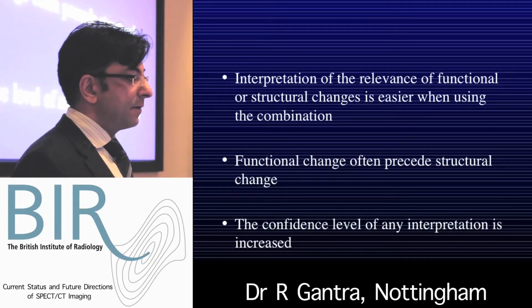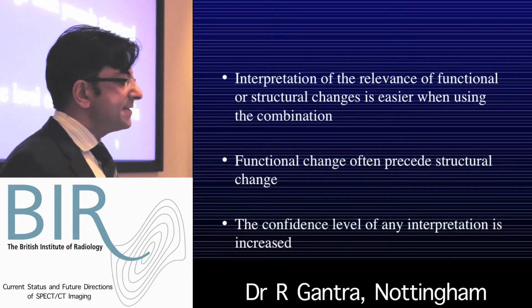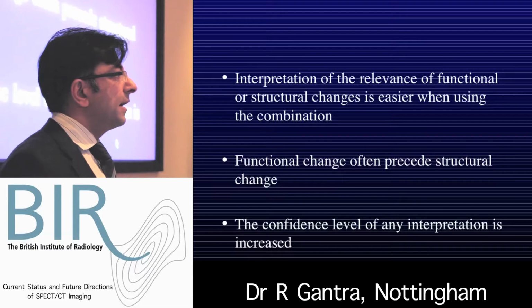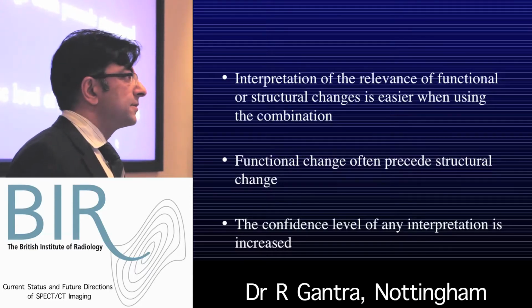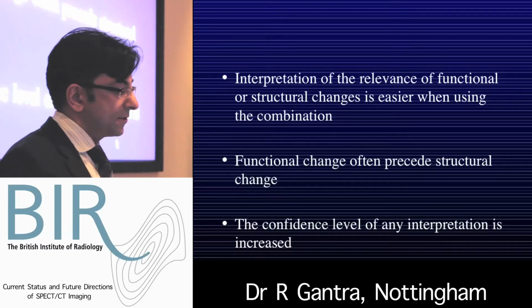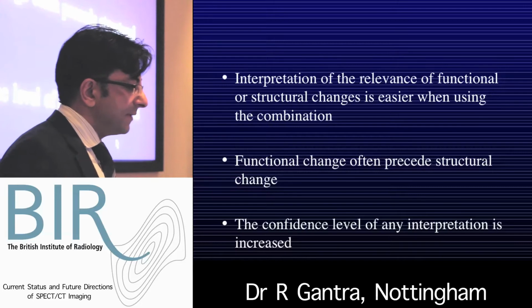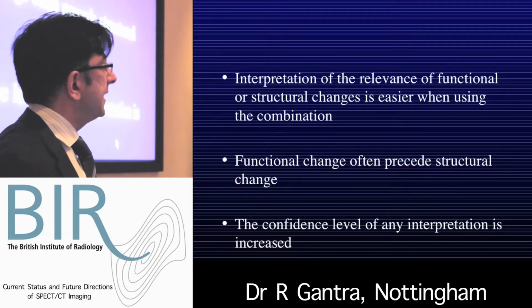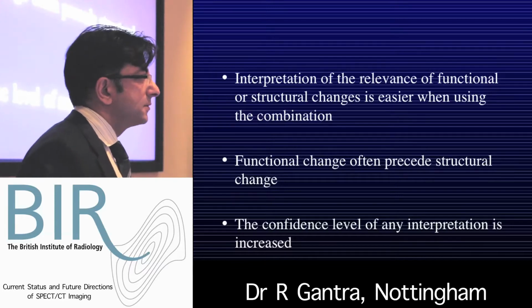And I think everybody will agree that the interpretation of the relevance of functional and structural imaging is easier when you have both together, either co-registered or side by side. Functional changes do precede structural change. And this is the real crux of it, that our confidence level of interpretation is much higher when we've got both functional and structural change.